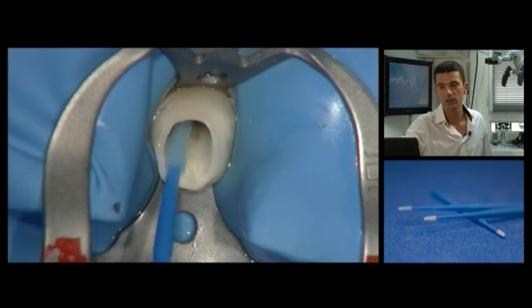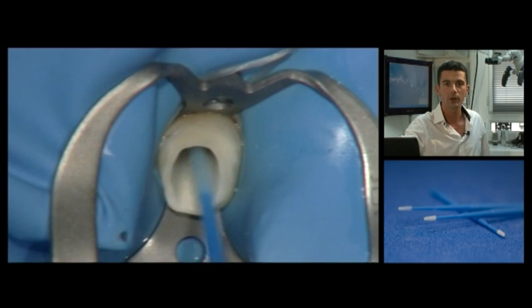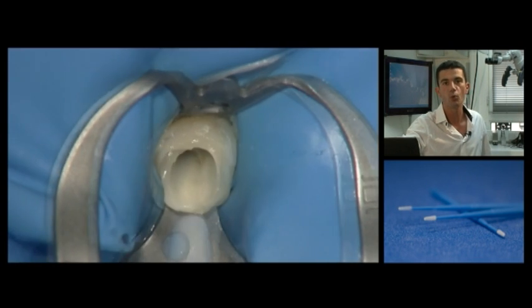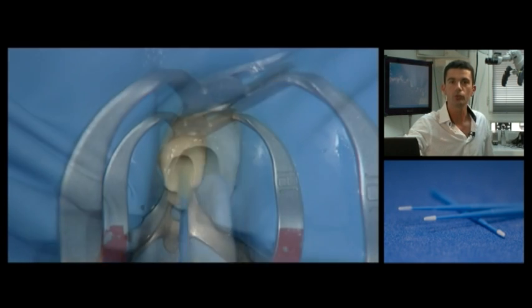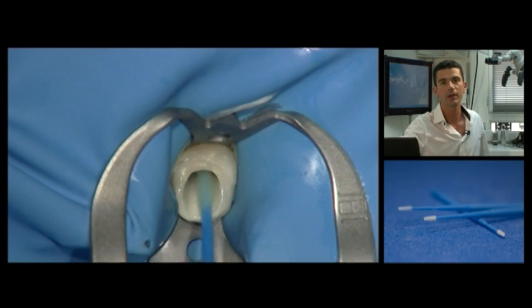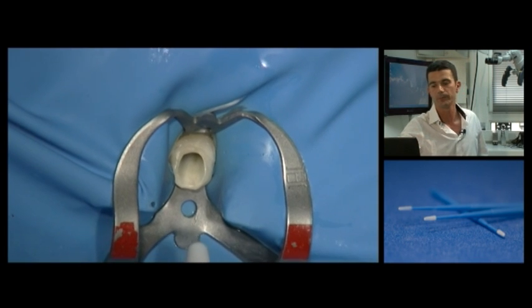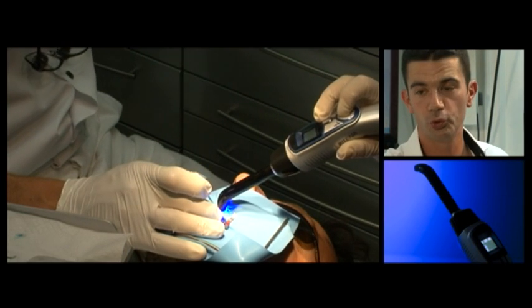Next the pre-mixed adhesive is applied with a special micro brush, taking care to brush the walls for at least 20 seconds. Excess solvent is allowed to evaporate for 5 seconds. Then a second layer is applied for 5 seconds and evaporated for 5 seconds. The adhesive is then light cured.